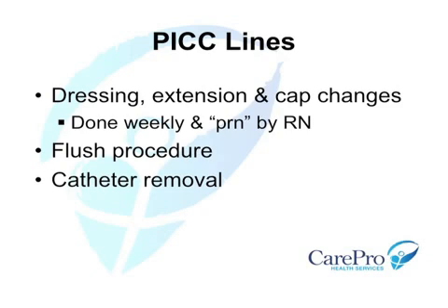There are several types of needleless caps available for use. With most catheters, it is best to use the positive pressure cap, as this exerts a continual forward pressure of the flush solution into the catheter. It is extremely important that the catheter not be clamped, as this disrupts the positive pressure function of the cap. One exception is changing the extension on an open-end catheter.